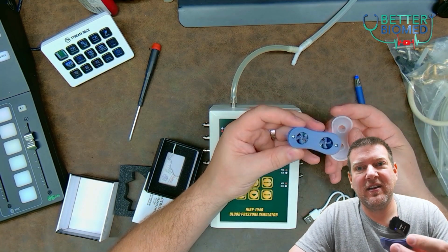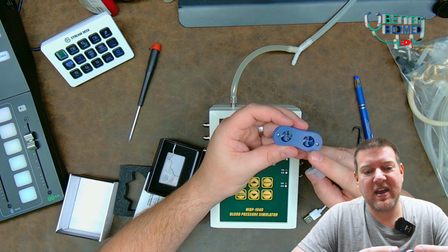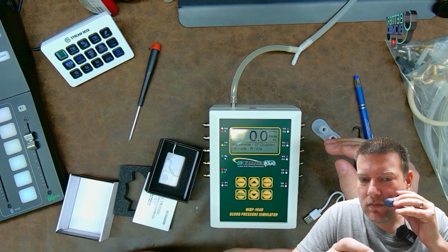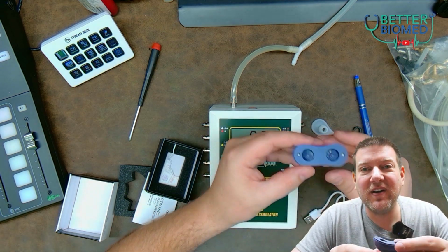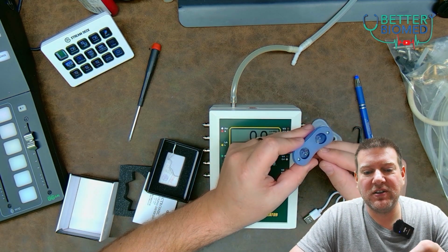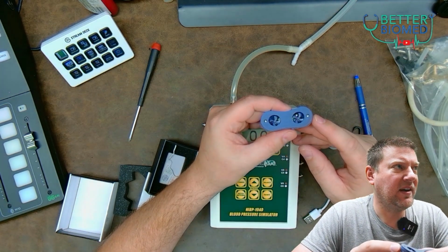Look at this. I can open it up. You guys can see the micro fans. Oh my gosh. These are not the type of fans that have static pressure anyway. In fact, those guys probably barely move any air at all. They're literally not doing anything. I can feel it moving here, but they're literally not moving any air whatsoever. And why would they? Because first off, they have really tiny blades.